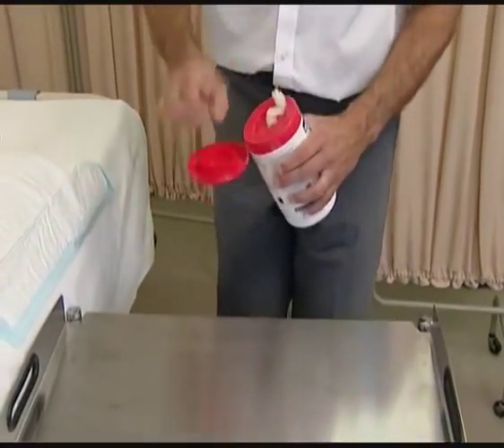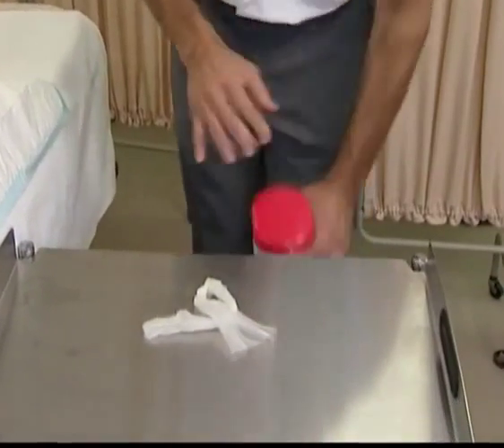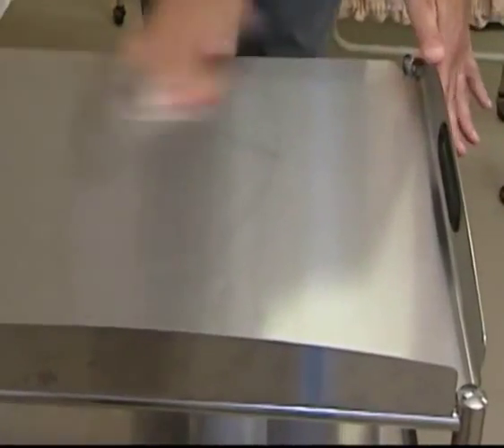Clean your working surface — this may be a trolley, a tray or a bedside table — using a 70% alcohol wipe for hard surfaces.